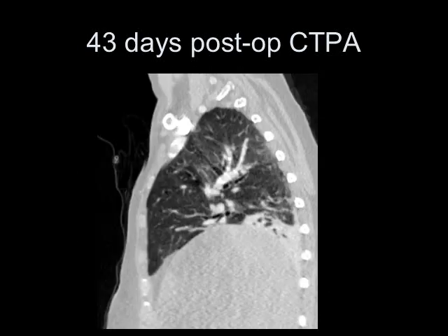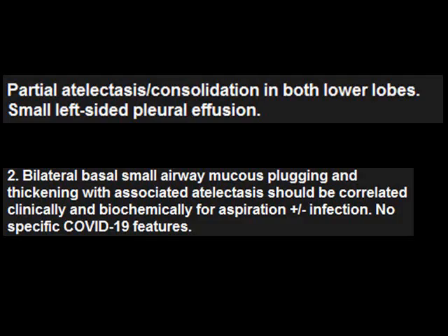On the sagittal view you can see the volume loss within the area of collapse. The day 43 post-op CT report says 'partial atelectasis/consolidation of both lower lobes' — again the reporter is unable to distinguish between the two. They are different diagnoses: atelectasis would be treated with pain relief and chest physiotherapy, whereas consolidation in the post-operative setting would be assumed to be infective and treated with antibiotics. There was also concern about COVID-19, as at the time of recording we were in the middle of the pandemic.